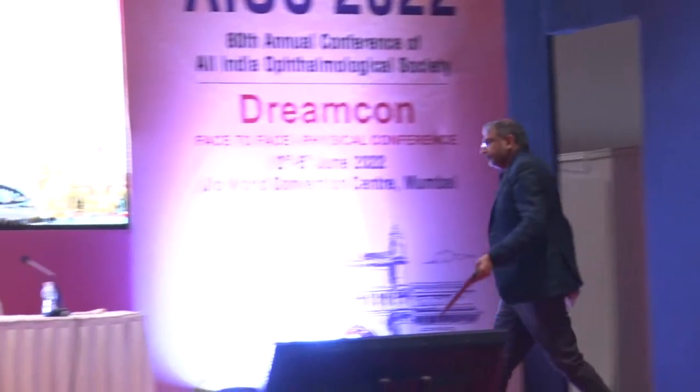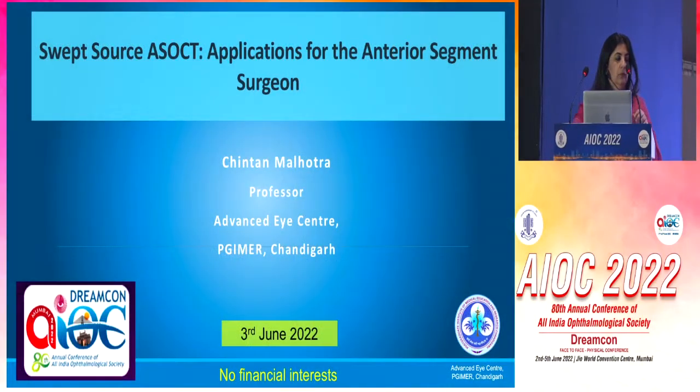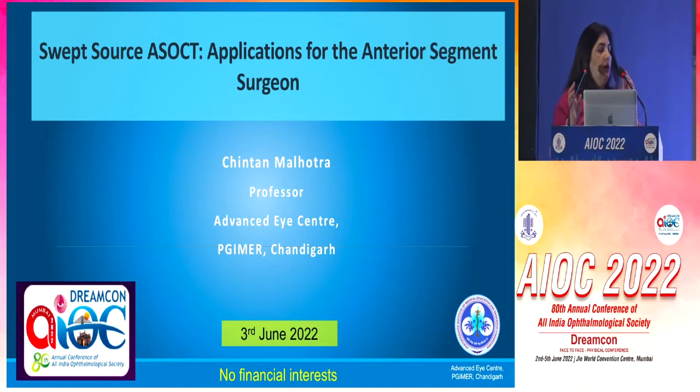Thank you so much. And we go on to Dr. Chintan, and she will be talking about anterior segment OCT and swept source anterior segment OCT, and what are the applications for the anterior segment surgeon.